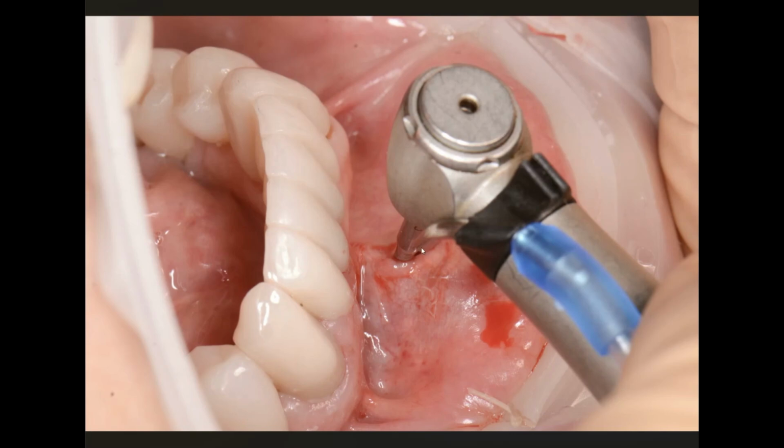Then I'm going to take an osteotomy drill, something like a 1.4, 1.6, 1.8 drill, and I'm going to just make a hole right in the center of the mandible. Now, in my mind, I'm going below the mental trigone, below the top of the pyramid. That way it will be completely out of my way for alveoloplasty. And I'm angling this out at about a 30-degree angle, okay?